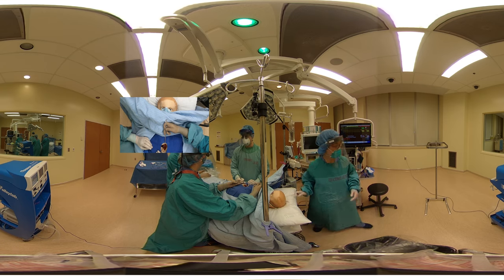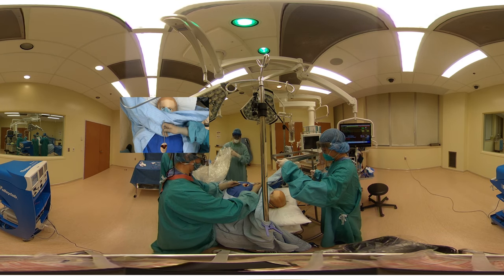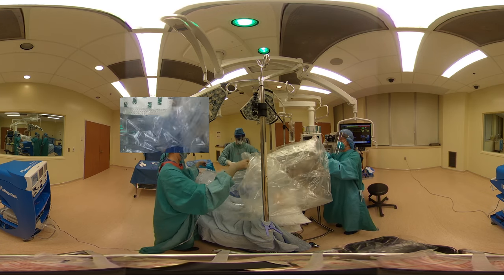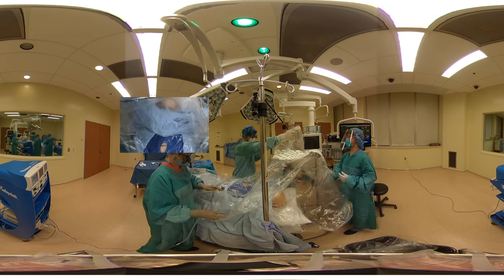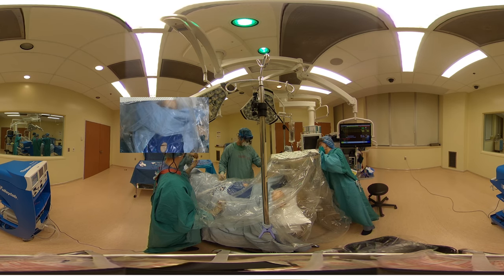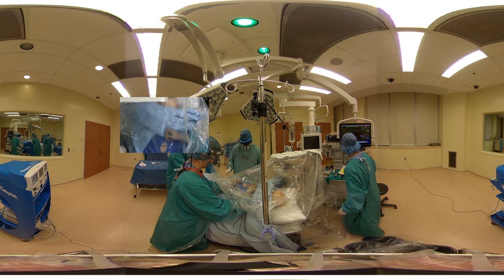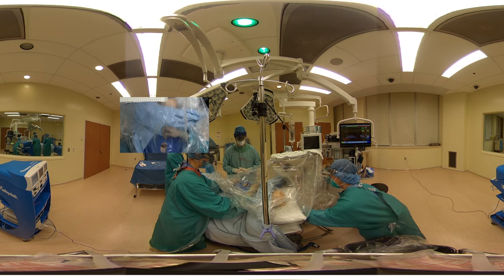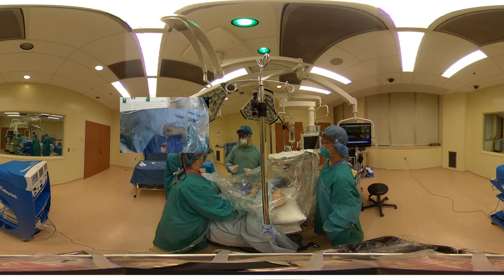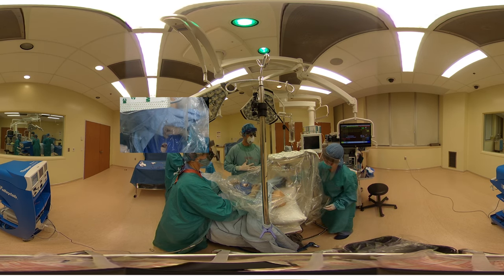Do we have the hip fracture drape, please? We're going to set up a tent over the area. Okay John, we're going to put a little special tent here — don't worry, you can still take those nice deep breaths. So to go over the plan: we will make our tracheotomy incision, get the tube in, connect the cuff, inflate the cuff, connect the inline suctioning and the HME, hand it off to you. You'll confirm end-tidal CO2 and then induce anesthesia.